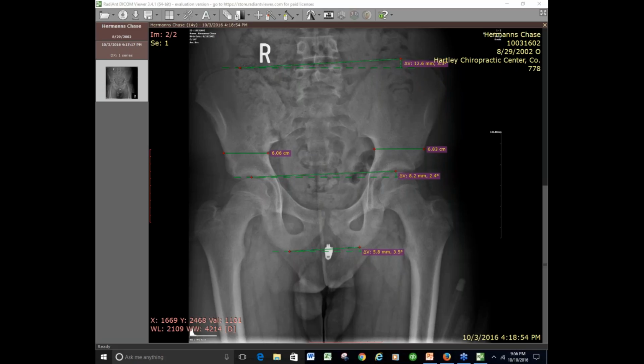Yeah, it follows the sacrum equally. Right. And if it doesn't, if one's lagging, I usually think the hamstring is tight on that side, the lagging side. Sure. Something is stopping the movement from happening, and whether that's the hamstring, right? There could be a couple other things, but yeah, same idea.